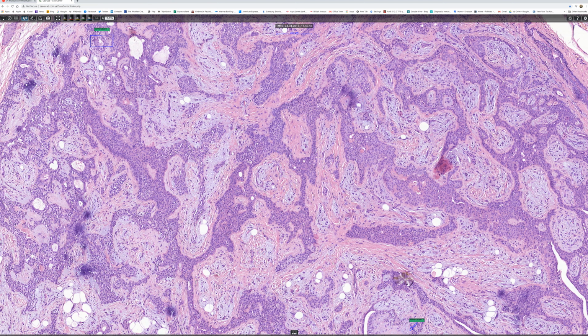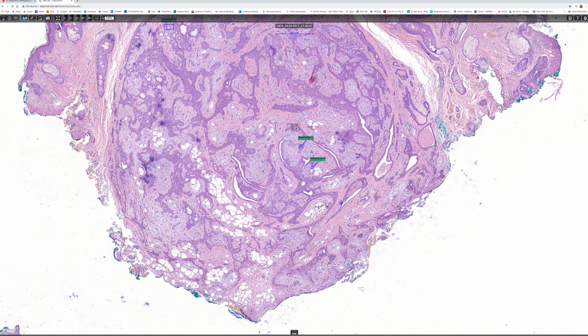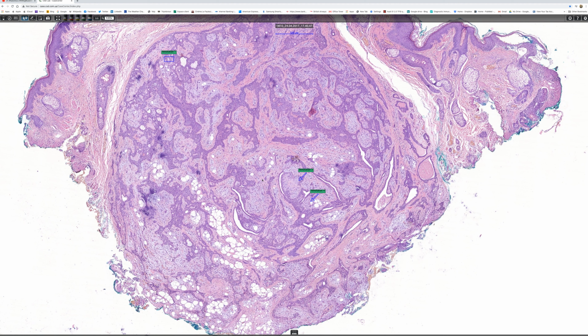And just when we're talking about atypical, we also need to think of hidradenocarcinoma arising in a mixed tumor, so-called malignant chondroid syringoma, and that's a dreadfully rare tumor, and it's a high-grade tumor with significant metastatic potential and mortality.